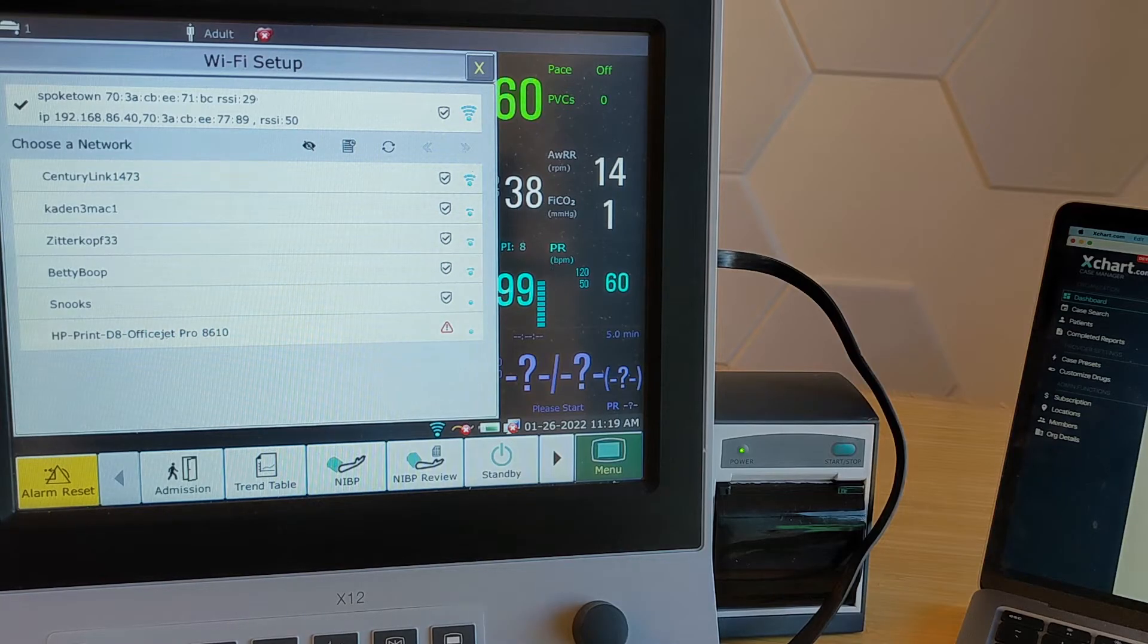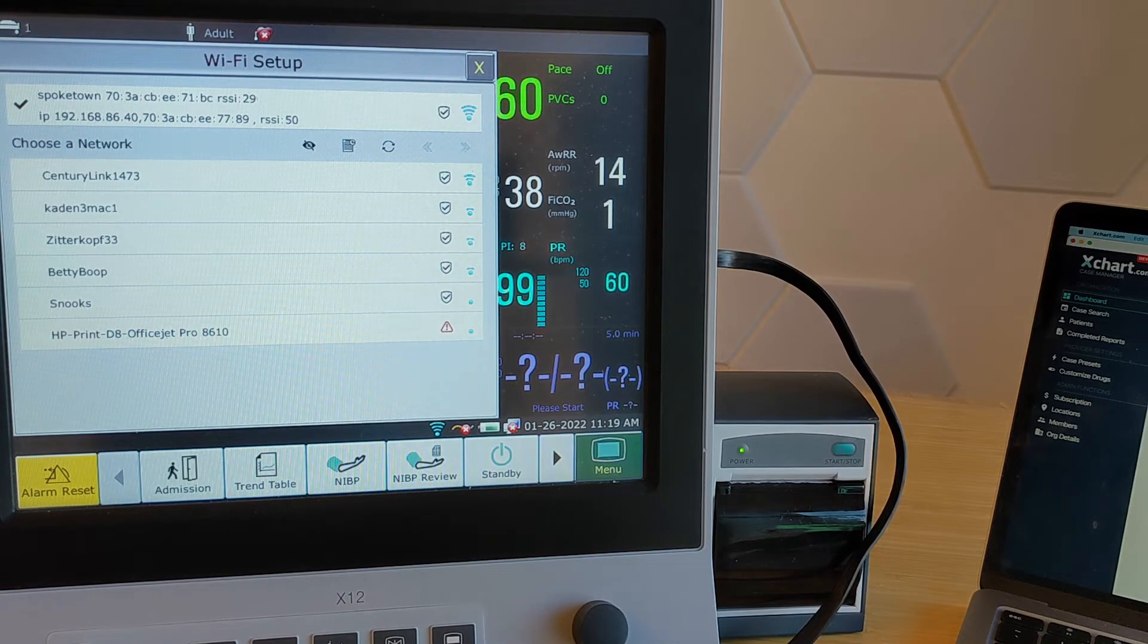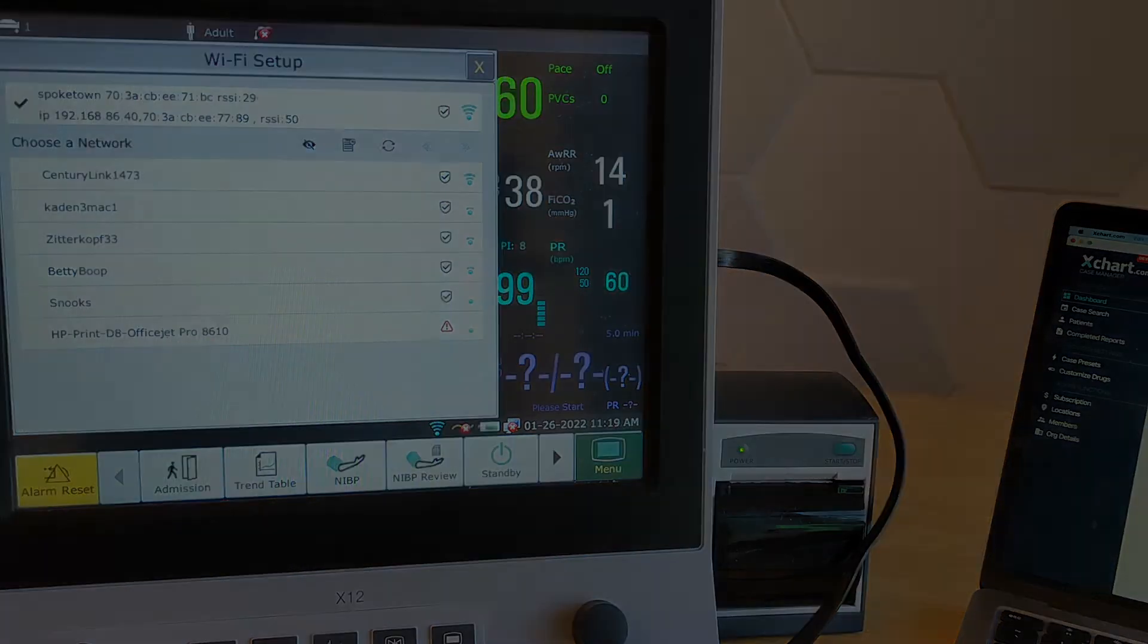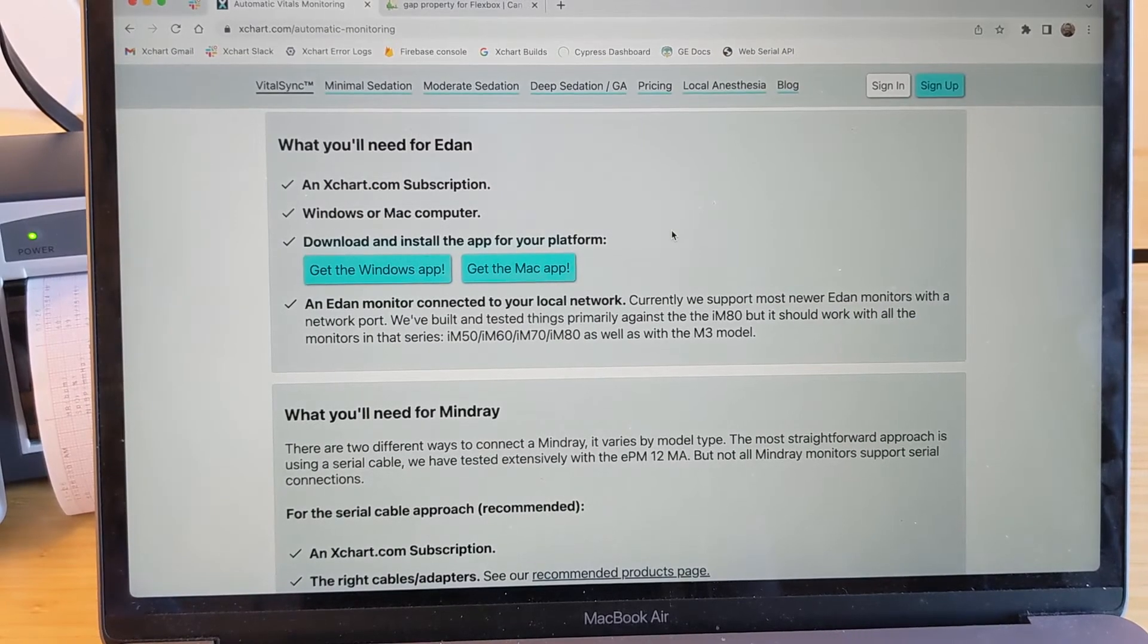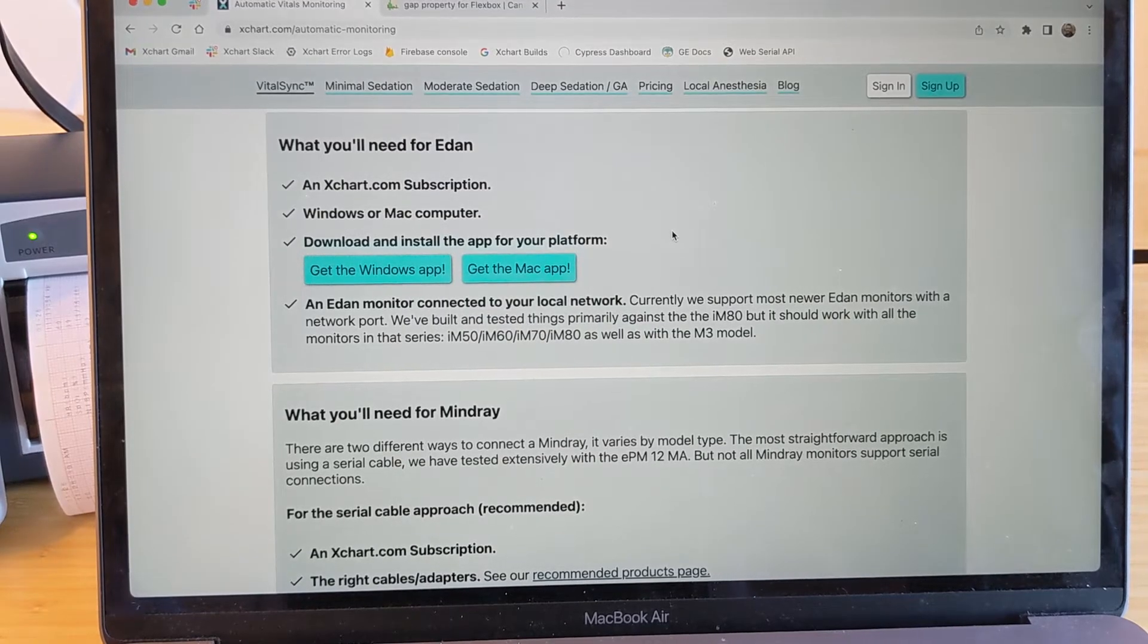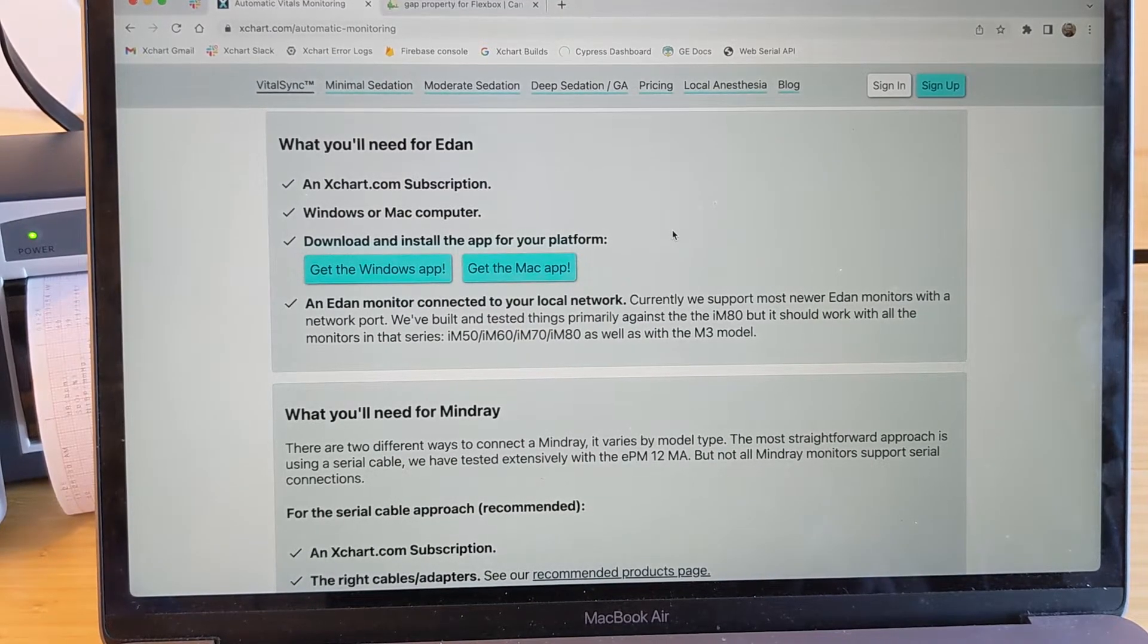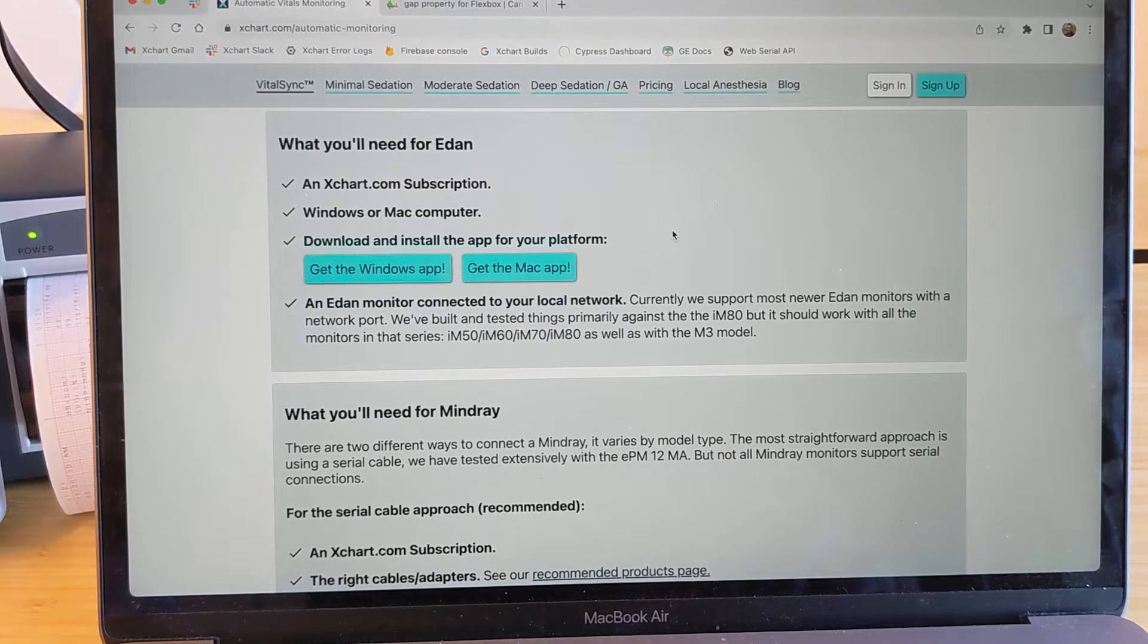I'm going to go ahead now to actually switch to the downloaded software so you can see how it looks when you connect it to Xchart. In order to talk to devices on your local network, we need to have you download and install the appropriate desktop app for your system.